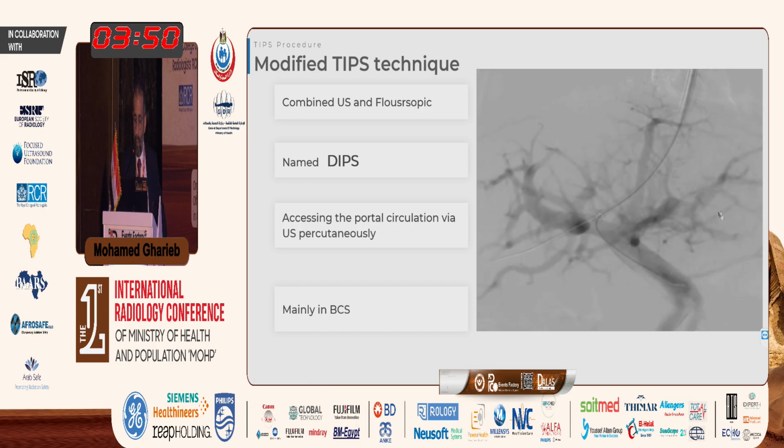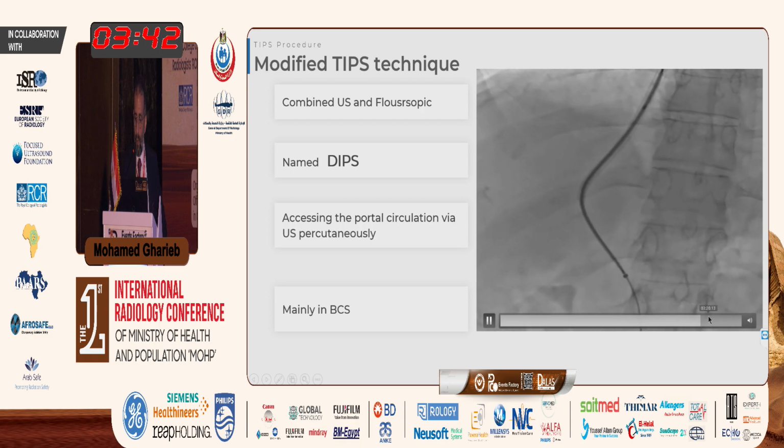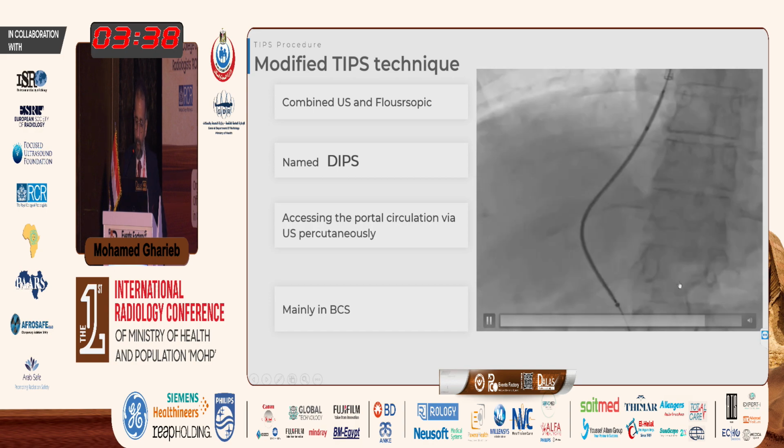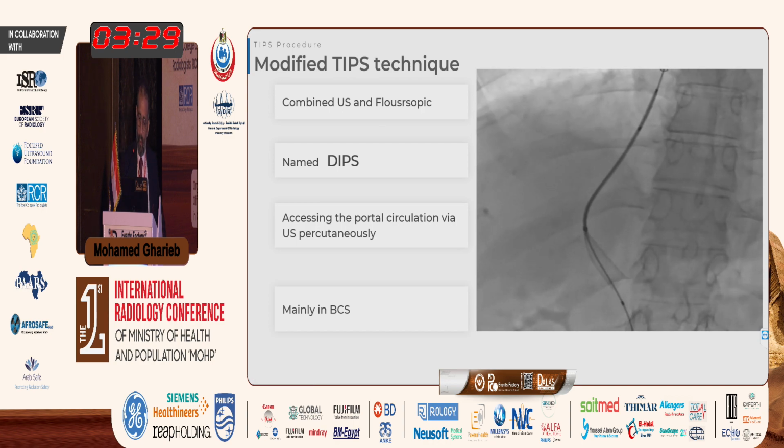Less than 12mm mercury pressure gradient is accepted and good in this patient. This is dilatation of the tract after. Then this is the bare metallic stent that usually we use. Covered stents now have become expensive, and I don't think after our financial issues lately, how will it cost?